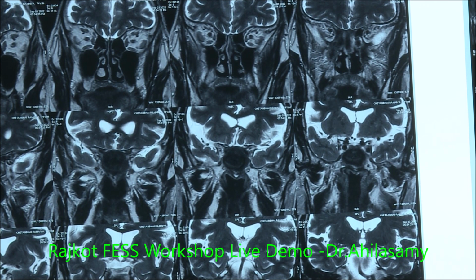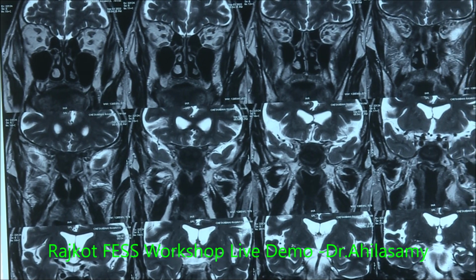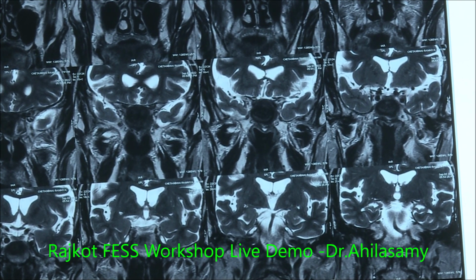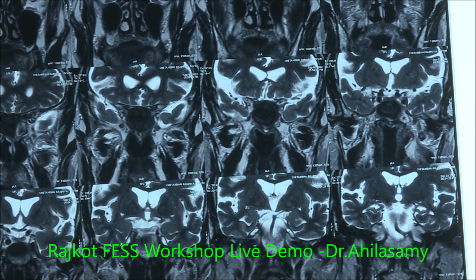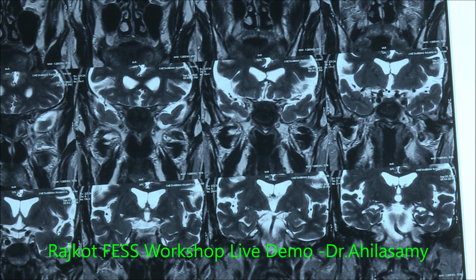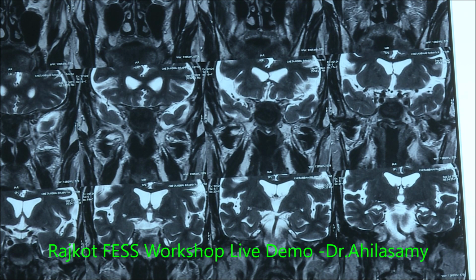So I have to work very closely with the team and the anesthetist. It will be a tricky case. For GA, the patient was not fit. They didn't give the GA fitness also, so I can't convert it to a GA. It's a bit tricky. Let's pray for the best. But our good anesthetists have told us they will cooperate excellently. We are sure that you will do very well in local anesthesia.